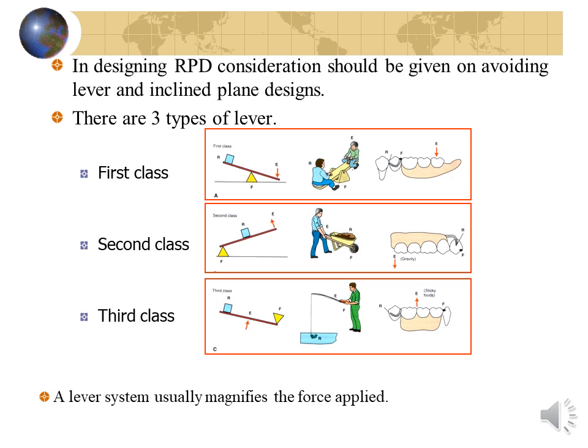When a force is applied against an inclined plane, it may produce two actions. One, deflection of the object which is applying the force. Second, movement of the inclined plane itself. These results should be prevented to avoid damage to the abutment teeth.